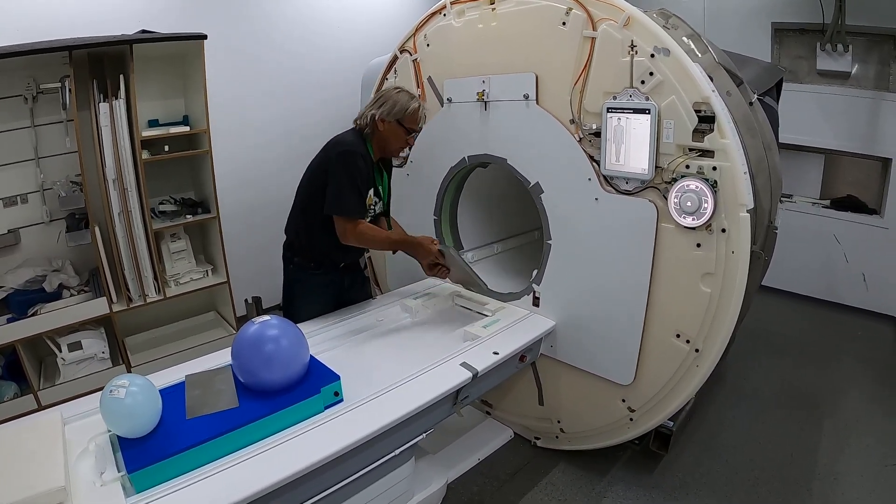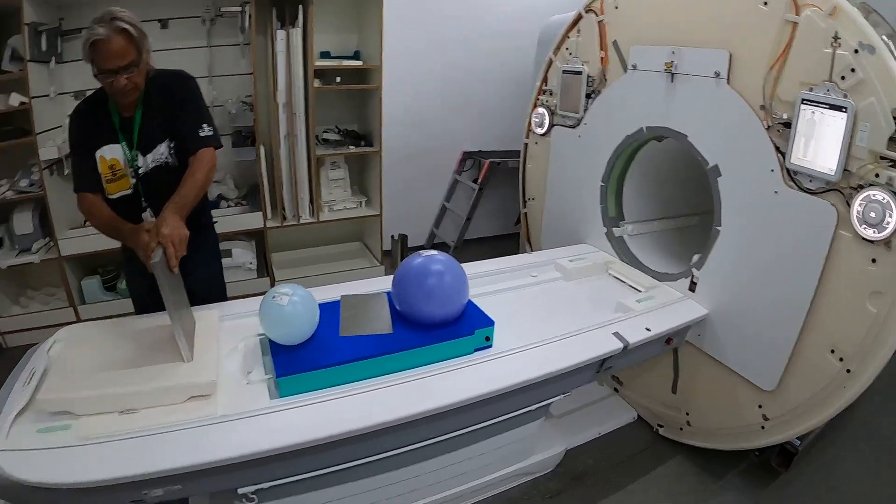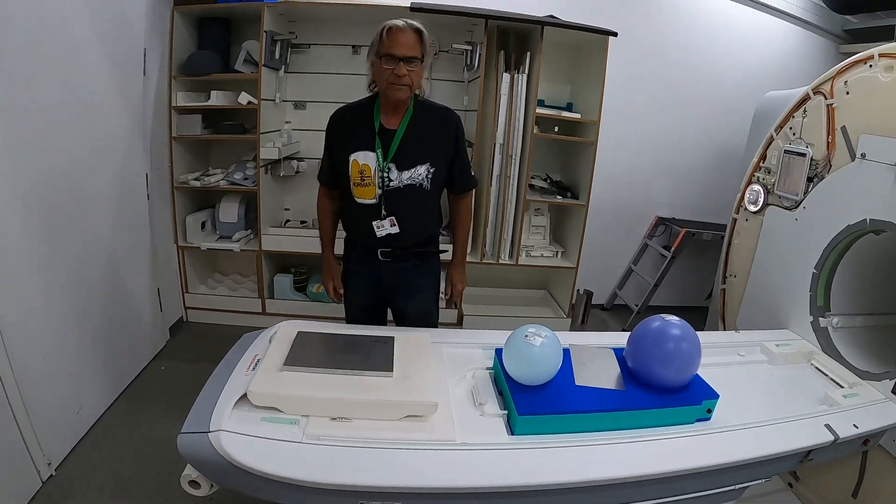And just to show you nothing special — it's way away from the magnetic field now.